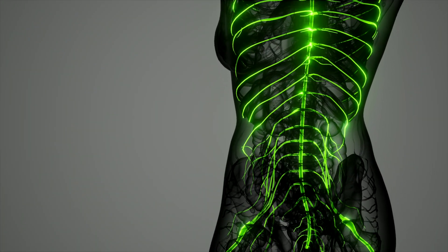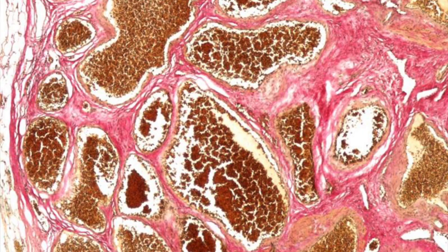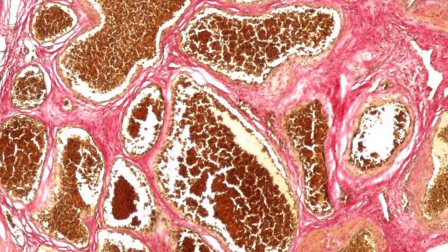Today begins the first of a two-part operative video series entitled Operating Inside the Spinal Cord. In part one, we'll review the basic anatomy of the spinal cord, why and how we access the spinal cord safely, and I'll show you a video illustration of a case where I operated inside a woman's cervical spinal cord to remove a vascular malformation known as a cavernous malformation. In part two, I'll take you inside the operating room and show you what the spinal cord looks like, including the patient's cavernous malformation and the steps I performed to remove it safely. Feel free to jump forward to the animated illustration later in this video, but for those who are curious, let's discuss some background on spine surgery, spinal cord anatomy, and this particular patient's case.